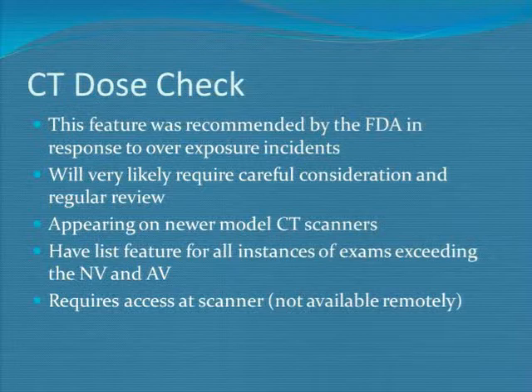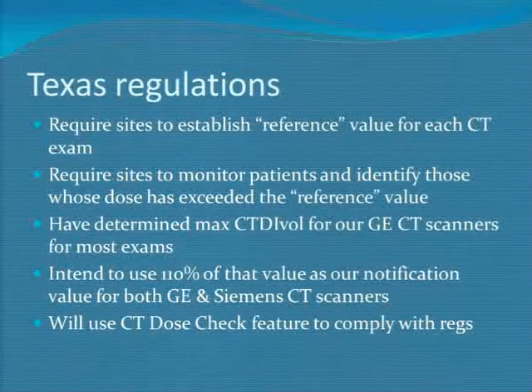But the other thing that's one of the not so great parts of the audit tool piece is that you have to take yourself to the scanner and do it. And I think you hopefully will be able to put those results on a memory stick. We should be able to get that figured out. But it's not something that we have figured out how to do remotely. So we couldn't sit at our workstation, many miles away, and get this electronically. So far, they all seem to require you to actually physically be there.